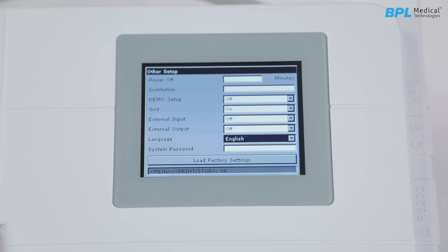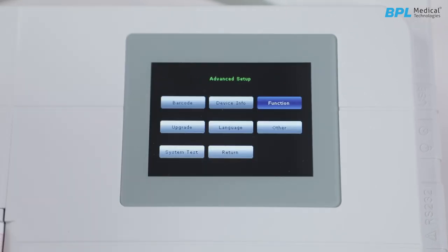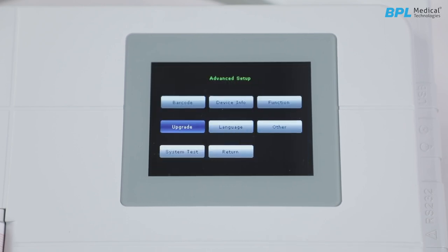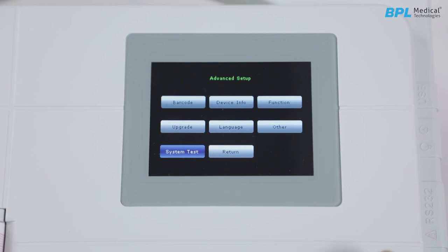Language is English by default. Advanced setup can be enabled once the password is entered. In the advanced setup there is a barcode option, device information, functions, measurement analysis — which can be enabled, disabled or set to measurement only — an upgrade option, language setup, other setup, system test and a return option.